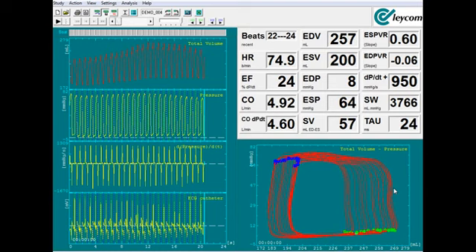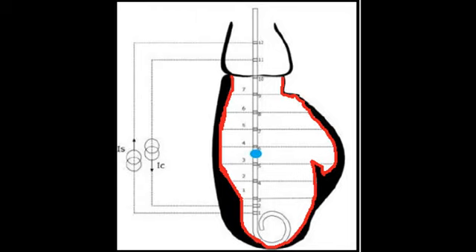As such, the Inca system is able to remove a phenomenon known as parallel conductance, which is an overestimation of volume being measured due to anatomical items contributing to changes in conductance, such as the ventricle wall, and not by the blood pool itself. Another way of stating this is that the hypertonic saline will essentially define the physical boundaries of the ventricle, as seen in red in this schematic, and provide an accurate measure of end diastolic volume, which will be used to calibrate the volume signal.